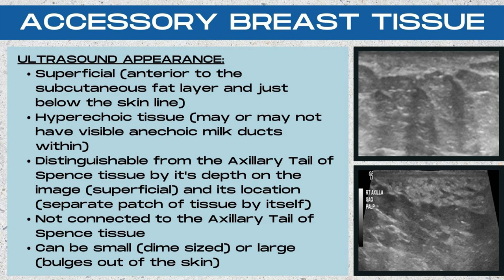The ultrasound appearance of accessory breast tissue is a hyperechoic patch of tissue. It may or may not have visible anechoic milk ducts within it. It's going to be located very superficially on the ultrasound image, just below the skin line and anterior to the subcutaneous fat layer. It's distinguishable from the axillary tail of Spence tissue by its depth on the image — it's more superficial — and also by its location, as it's a separate patch of tissue not connected to the upper outer quadrant breast tissue.